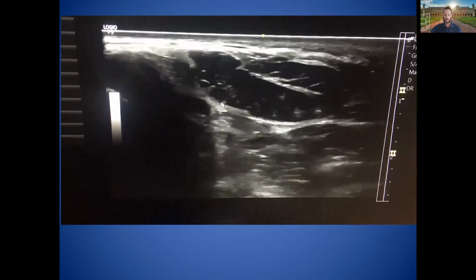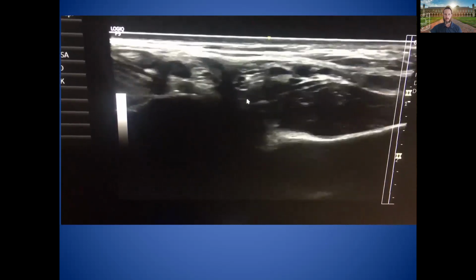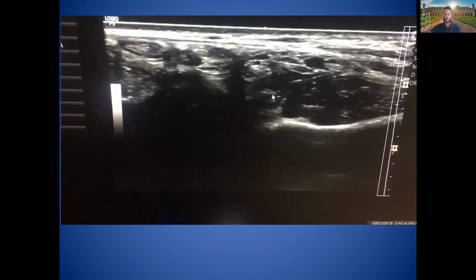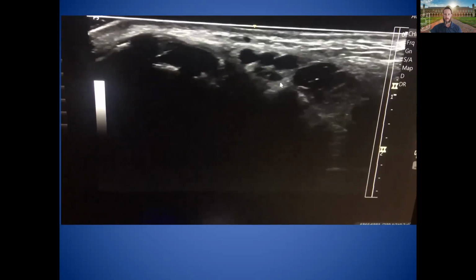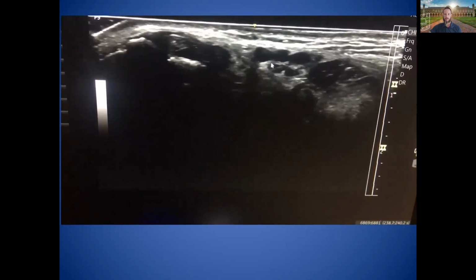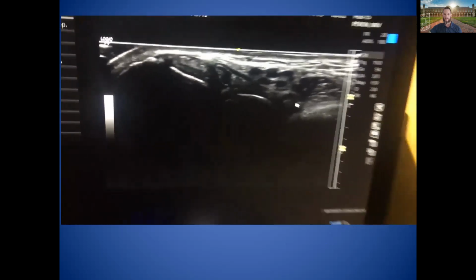So here, moving through, this is the tibial nerve, and deep to it is the tendon of the flexor hallucis longus, which I think is right down here. You can focus in here on the tibial nerve, and actually I'm moving proximal, and now this is the tibial nerve. I'm more proximal than I was before. Here's the artery and vein. Here is the flexor hallucis longus, and if you just want to show where I am over here, Becky, I'm right about this level here.